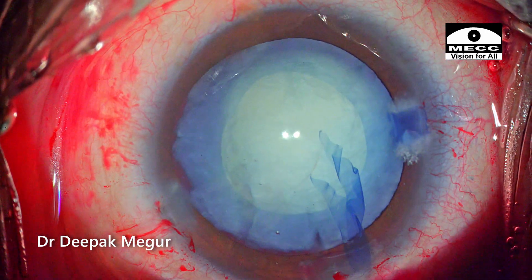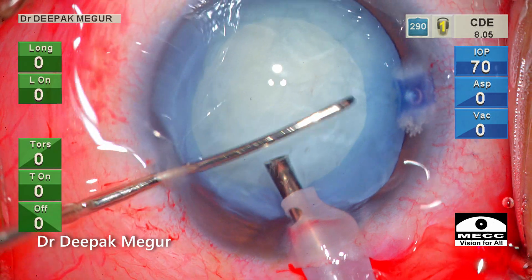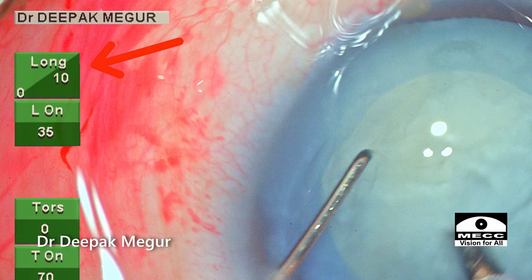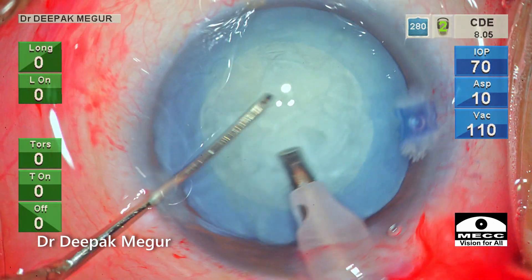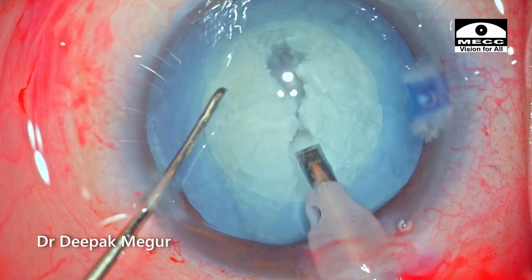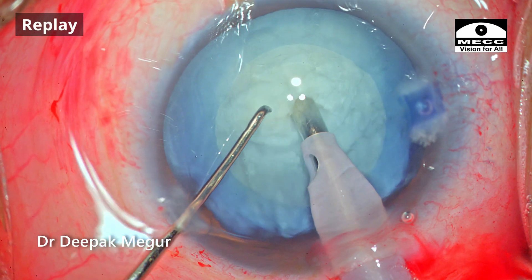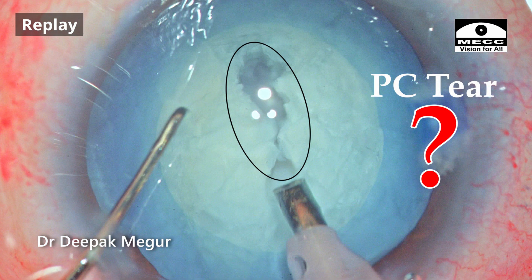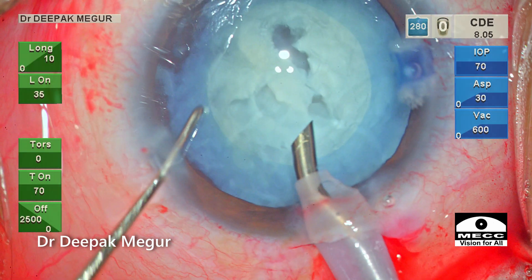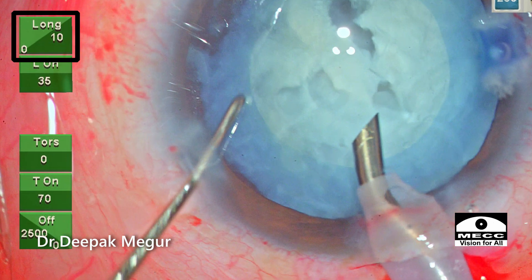Time to deal with the nucleus. I'm aware that in this young man the nucleus is going to be very soft, so I'm using a very low amount of energy. It is set at a maximum of 10% and it is set at longitudinal mode to bury my tip in. But suddenly as I'm trying to do this, a hole is created and it was quite alarming for me. The first thought was whether the posterior capsule had also been perforated. It was difficult to assess at this stage because the overlying nucleus was obstructing the view. I quickly went back and rechecked the power settings — it was set at a maximum of 10% only.